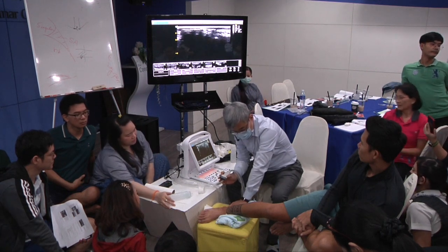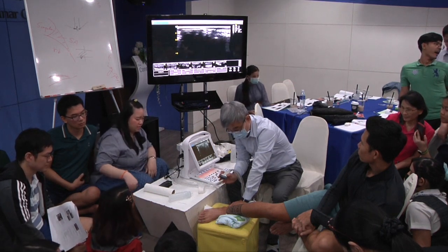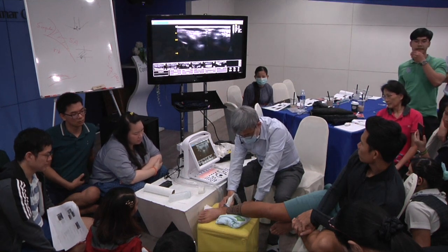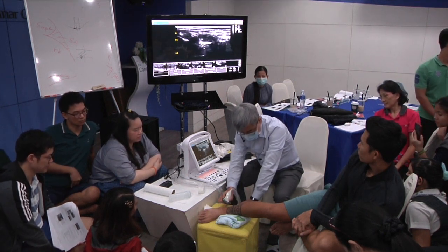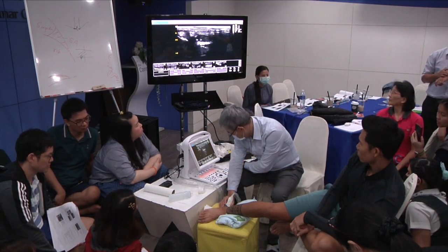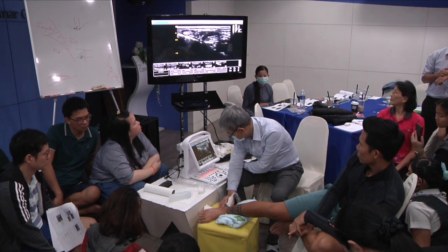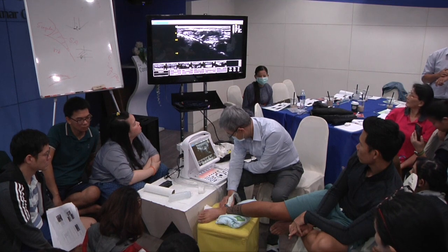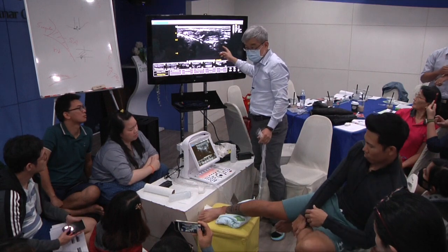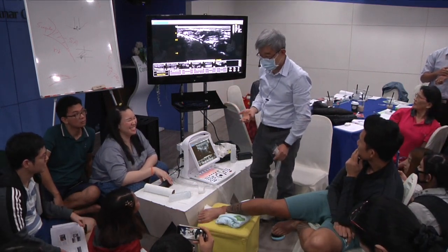Use the top of the calcaneus, and above that level, the other end is about the middle of the Achilles. Good, easy. Very bright, right? No problem at all. 5 ligaments. And then the last three.